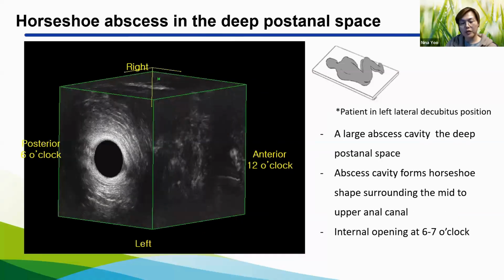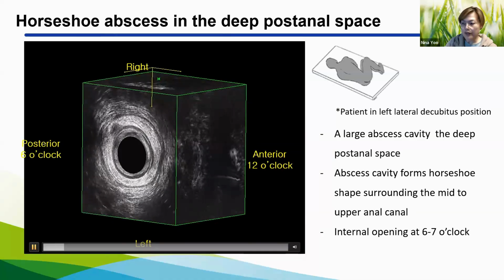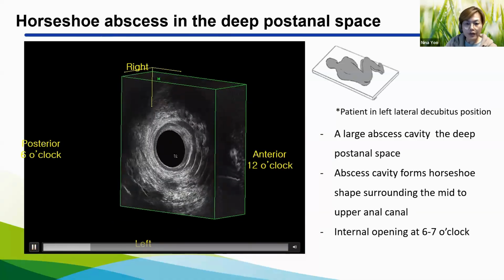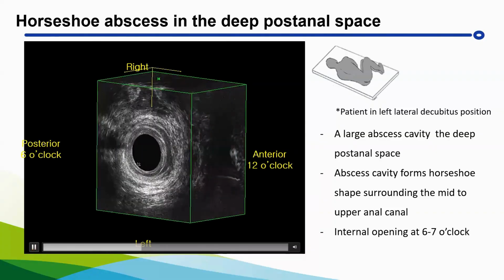Here's another example of a horseshoe abscess. Wow, it's not playing again. I don't know why, but okay, great. Okay, I saw the horseshoe shape. Yeah, it's playing now.